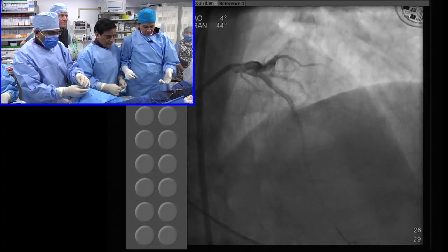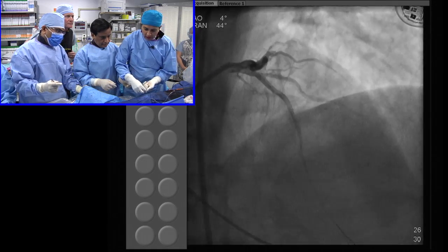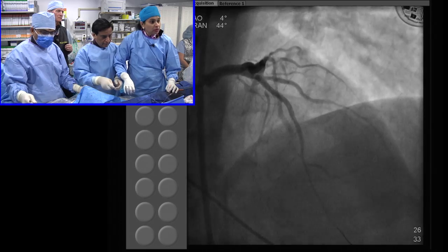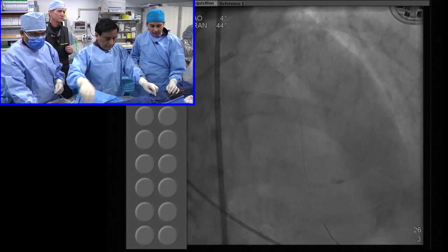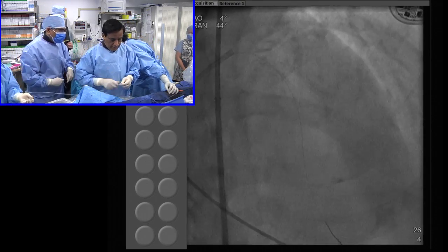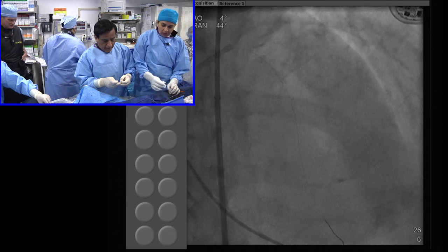Chuck, do you think proximally needs to be done? We are going to post-dilate with 2 different balloons. I think we'll go with the 3.0 to the distal part and probably 3.5 proximally. Yeah, that's okay, agreed. What have you opened? 3.25. Okay, which is okay, and then OCT ready?